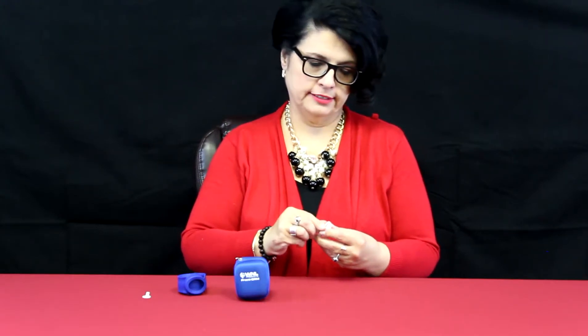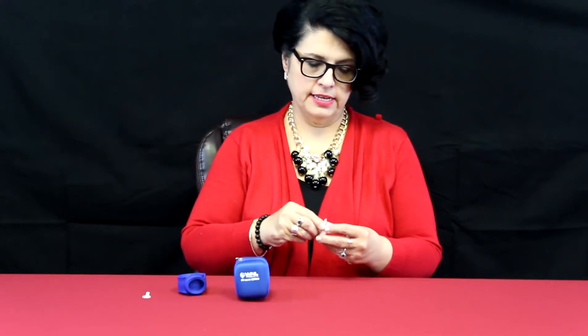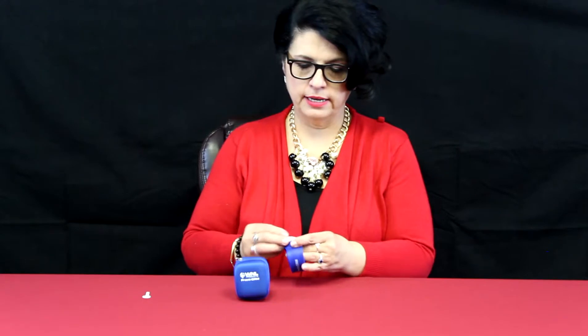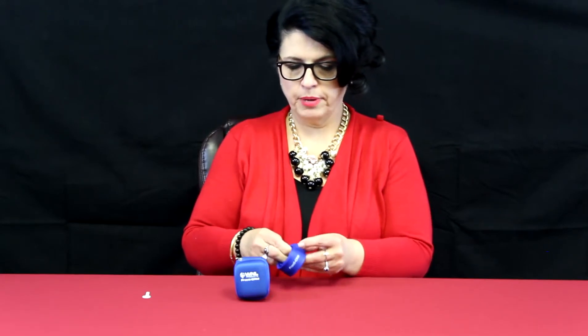I did not know that, and it is not in the instructions, unfortunately. But now I know. So you got that little tab out of there. You are going to put this back in — it just kind of pops back in.